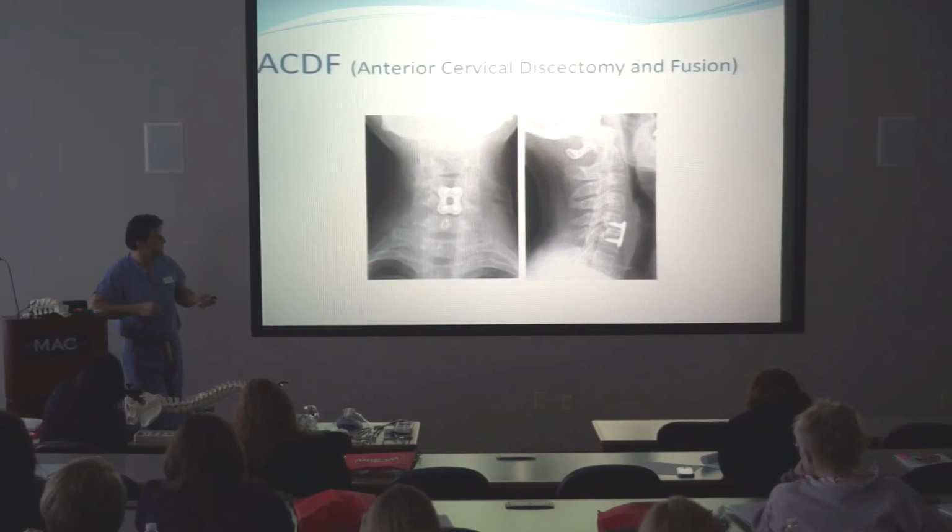So that's the little plate. Looks about the size of a postage stamp, and that's about the size. You'll see it up here.